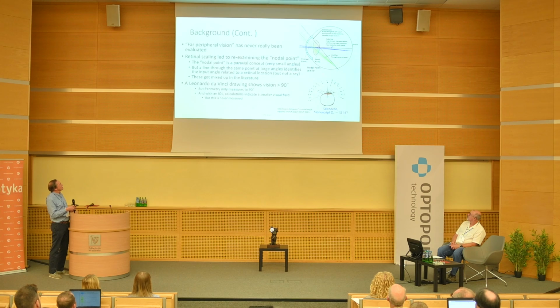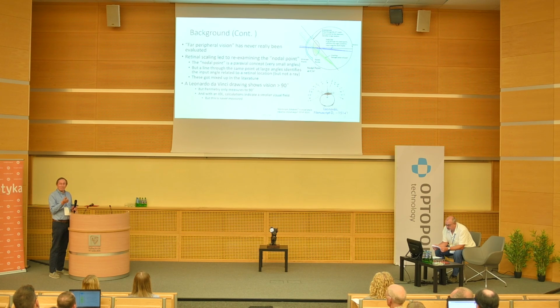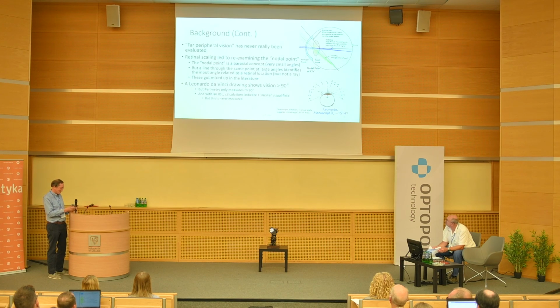And something I meant to emphasize a little bit is this nodal point at f prime over n prime. I realised when I got to the end of the road that I'd always done this, and I'd always noticed it. But if you look up where the nodal point is, you get the input angle equals the output angle stuff. Zemax has always done this: you calculate the focal length and divide it by the refractive index. But they never bothered publishing it, or I'm not sure who came up with it. It's kind of there in the literature, but nobody really emphasized it.